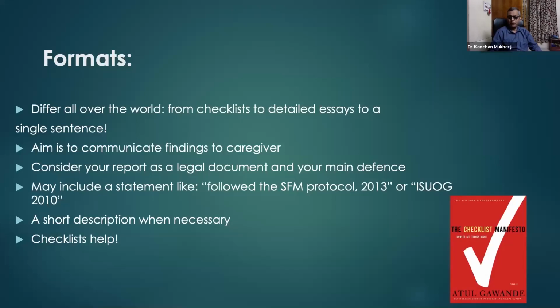My particular suggestion would be have a checklist handy. For each and every patient, if you have a checklist held with your attendant or the typist, they can guide you that, sir, madam, you have missed so and so things. Can you please check? And those of you who haven't read this international bestseller book by Atul Gawande, The Checklist Manifesto, I suggest you read that and you will realize checklists do help in life.